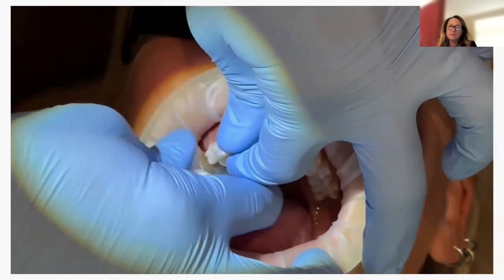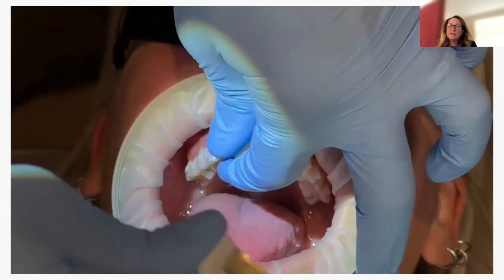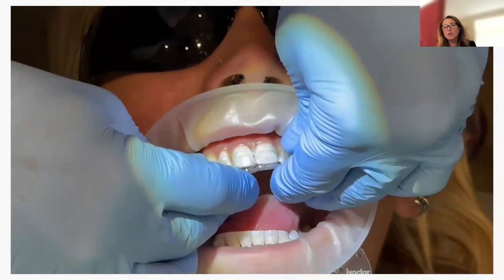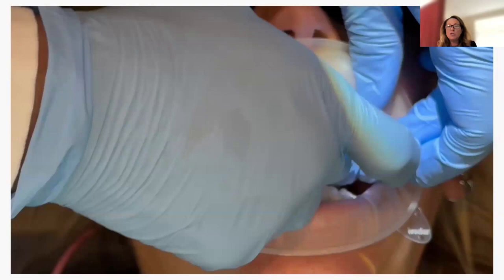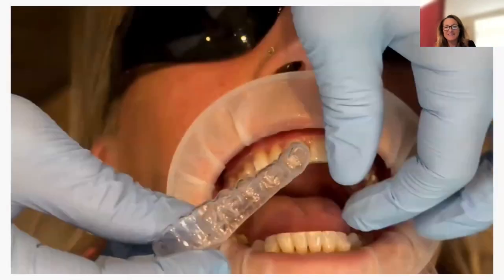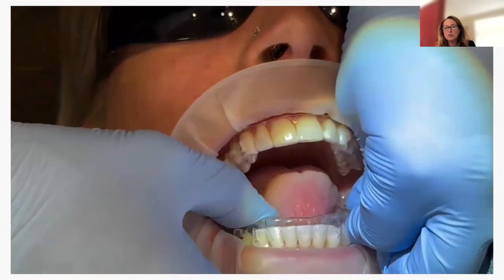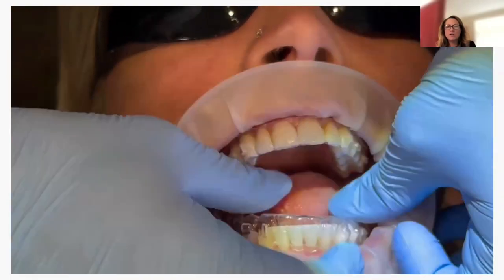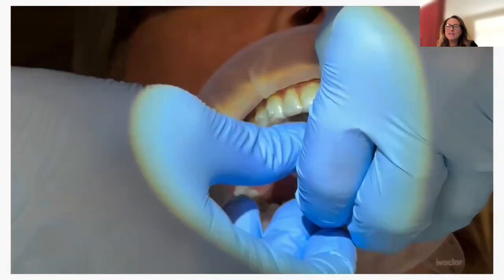And so, as you see, sometimes getting into those areas with the disc can be a little bit difficult. But this is the reason why you want to do your IPR after you place your attachments, because on some people, you just look at their gum tissue, what happens? Trying to get that hemo under control to do your etch and your bonding, you're going to make it too hard on yourself. We're trying to work smarter and easier, right? When we're dealing with saliva, it's hard enough.